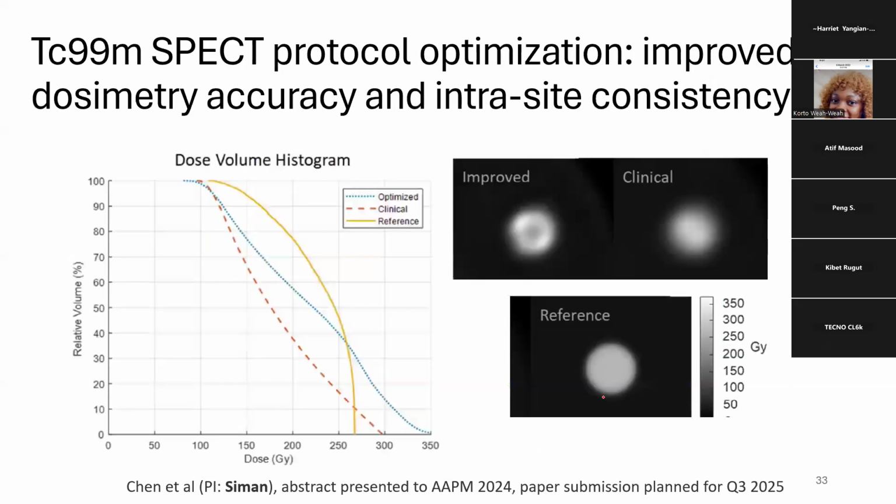Let's say we're looking at the mean or median. It's 50 gray already, right? The point I'm trying to make is that the variability, because of how you reconstruct the images versus how someone else reconstructs them, is already almost 100 gray, like 50 to 100 gray.